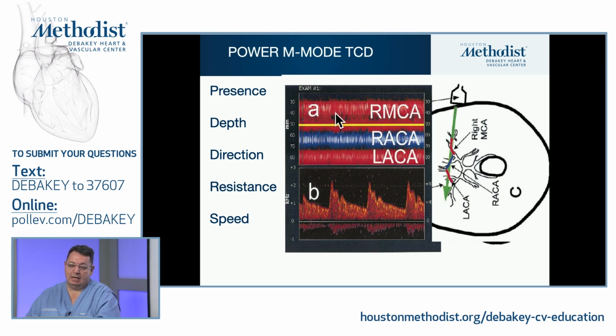So basically, if you're colorblind, just give up TCD right now. You really need to differentiate these colors. And again, the presence of the M mode shows you there's a flow in that area intercepted by the ultrasound probe. These signals are reflected with a 2 megahertz single crystal probe, reflecting from red blood cells. This is the motion, this is why we call it an M mode screen, and all the reflection you see is coming from red blood cells. If anything else travels in the system, you will be able to see some white lines.